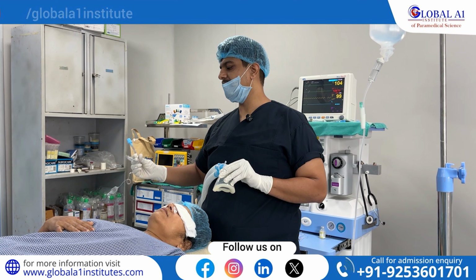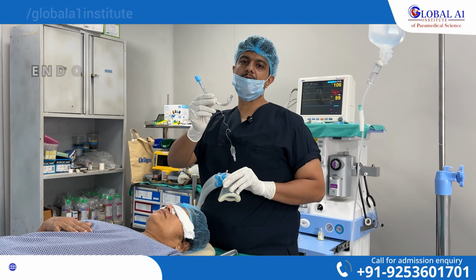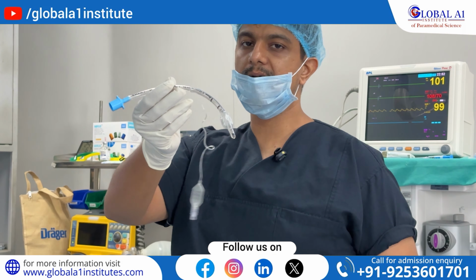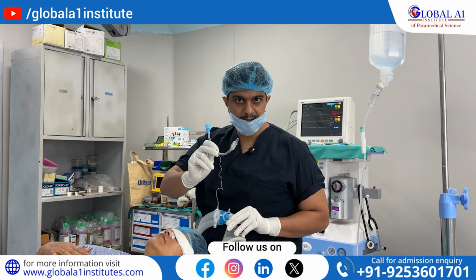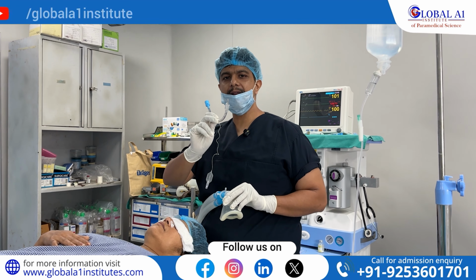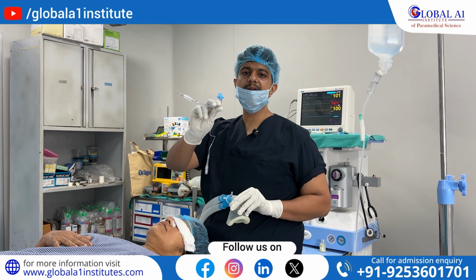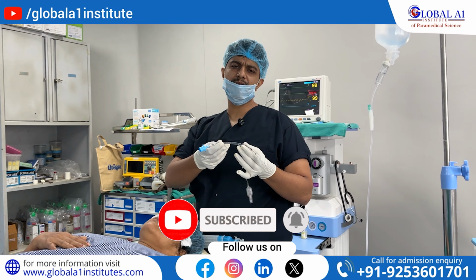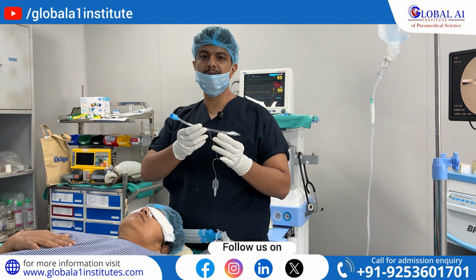And the other way of giving the anesthesia or securing the airway, we have this endotracheal tube. As you can see, it is a number 5 tube. It is a sample for you guys. It comes in different sizes, and different types of tubes are available: flexometallic, RAE tubes, South Pole, North Pole, and a simple one, the PVC endotracheal tube. It is called Portex, right? You can see it is a size 5. It is often used in kids of 4 or 7, 8, 9 years of age.